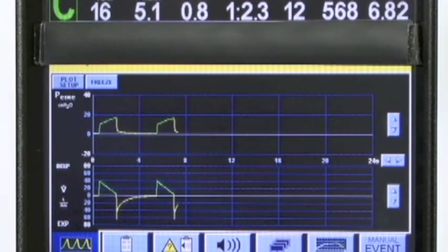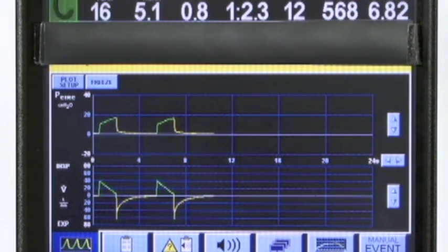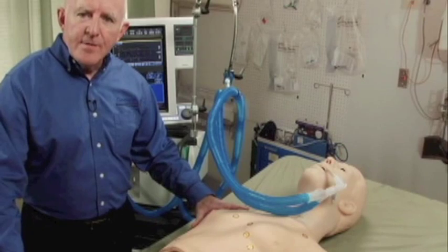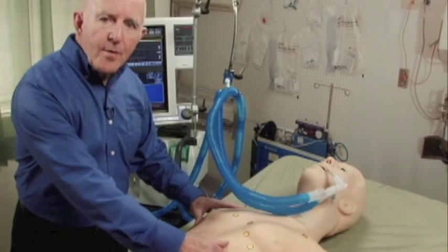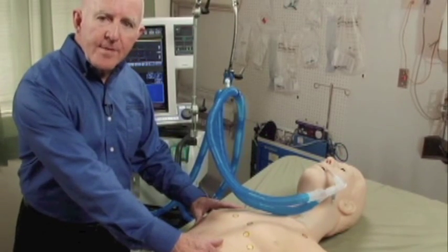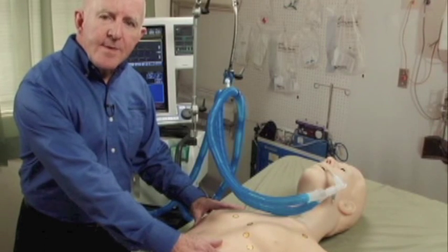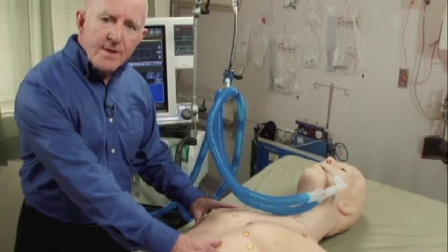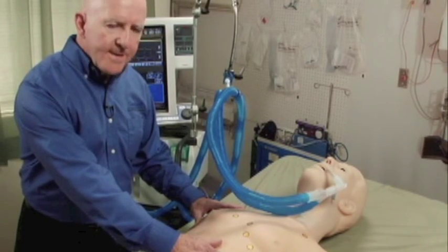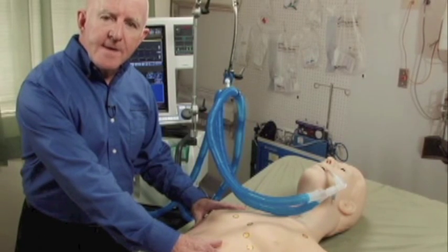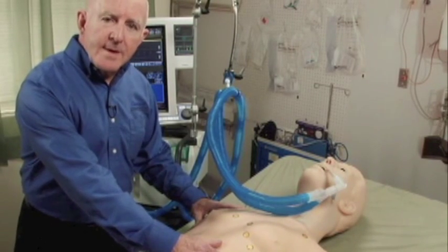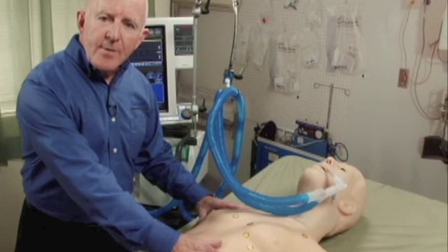HAL has variable resistance and compliance settings. With the resistance settings, we have 10 different levels of unilateral or bilateral resistance. The resistance can be set from a normal level, which it is on now, to a very tight, very stiff system that will result in airway obstruction.